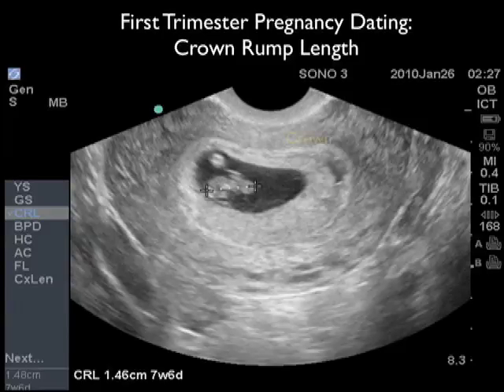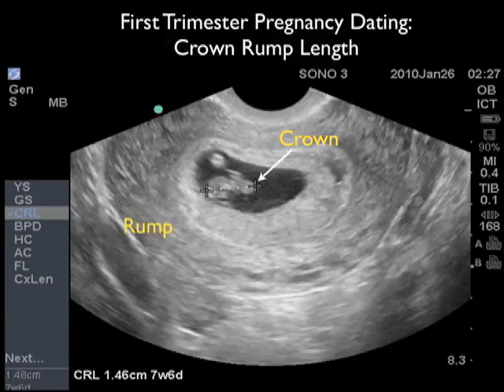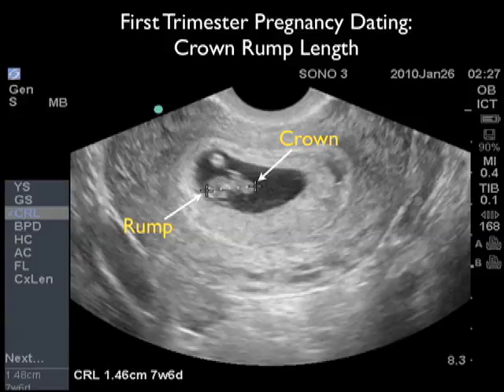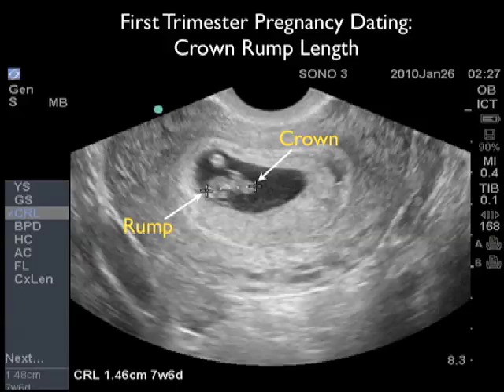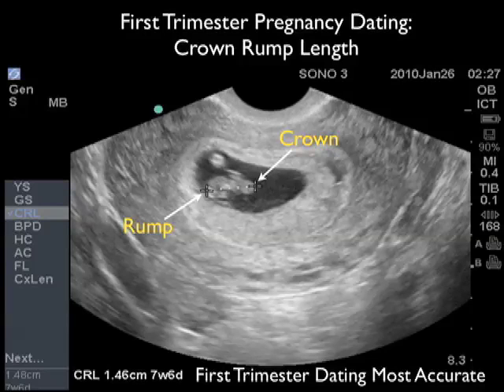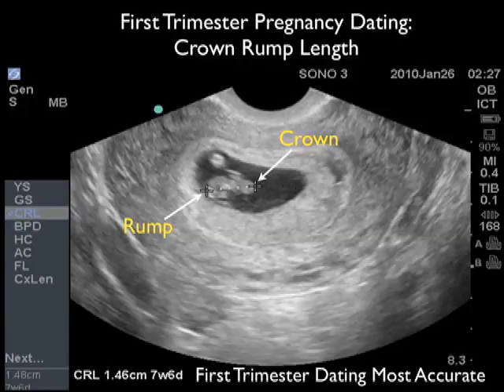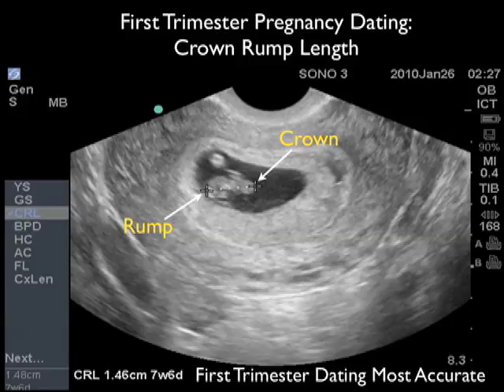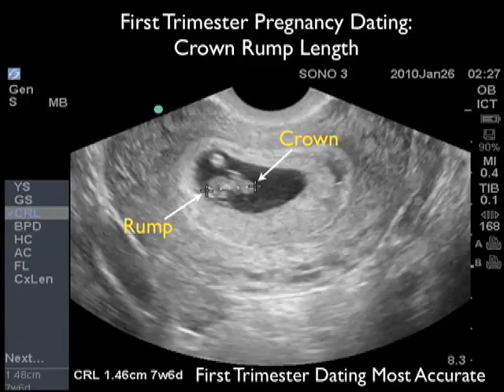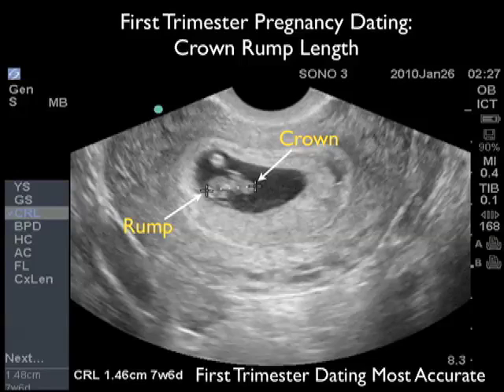This is an image of a first trimester pregnancy, and we're going to evaluate the gestational age by measuring the crown rump length. Here we see the fetal pole stretched across the gestational sac, with the crown located towards the right and the rump towards the left. Placing the calipers from crown across to the rump, we get a measurement of 1.46 centimeters. By selecting crown rump length in the software package on the ultrasound machine, we get an assessment of gestational age of seven weeks and six days. As first trimester dating is considered one of the most accurate during the entire pregnancy, it's nice to print this image out and give to your patient for their follow-up visit with their OB-GYN.